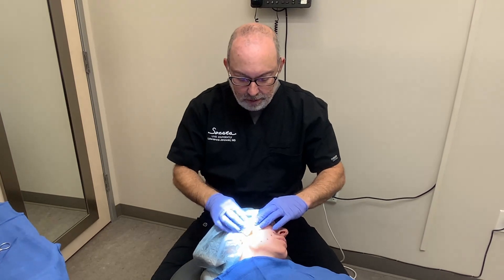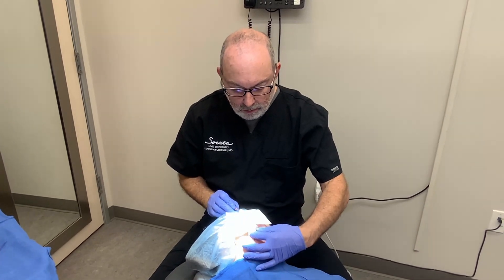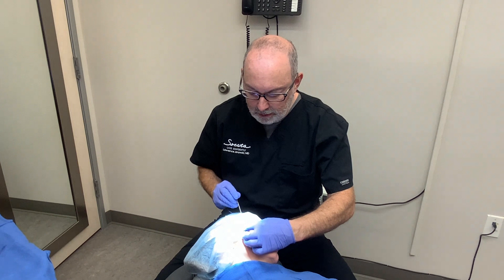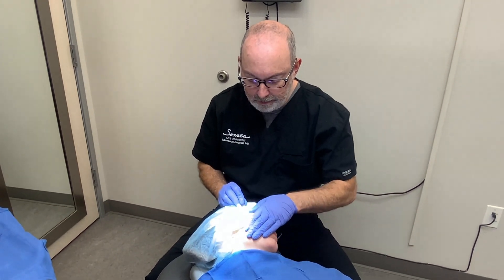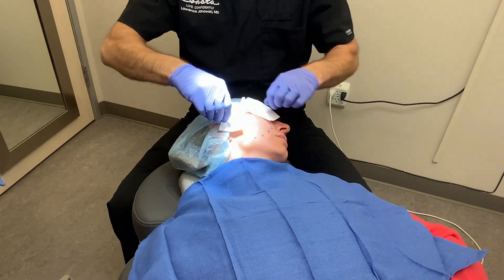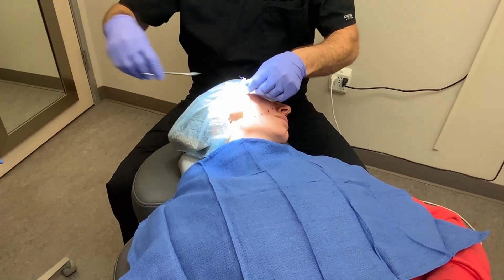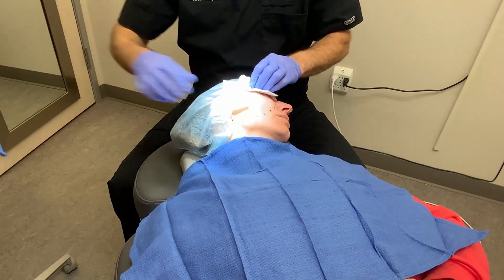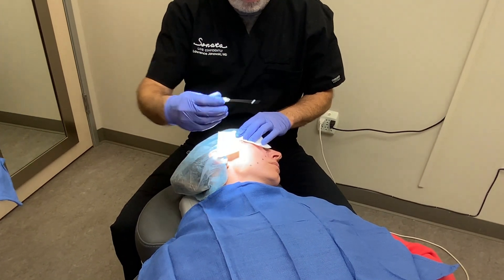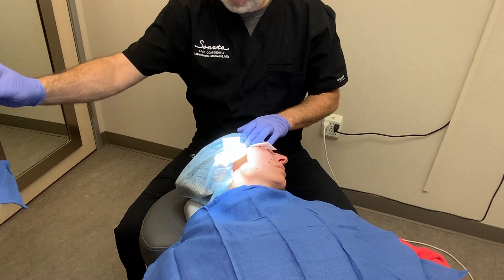Then we'll go back to the original point and do our third set, which is really more of a vertical lift — so we will cross over all these and place it right there, then straight down to the jowl area, and then we'll do another tie. The last set will go vertically — these are the petites, a little smaller — they will go up into the temporal area and create a nice anchor that will pull up vertically.